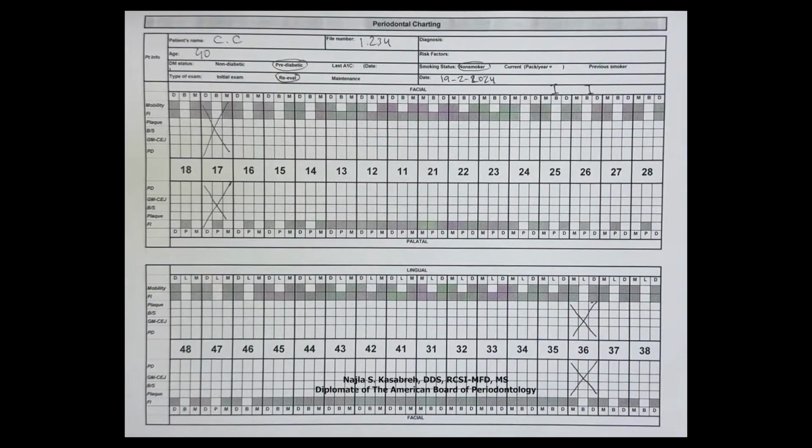On the left side, you can notice the parameters that you will be recording. You will record the pocket depth, the level of the gingival margin, presence of bleeding or suppuration, presence of plaque, furcation involvement, and mobility. Except for mobility, all other parameters will be filled out from the facial and palatal sides of maxillary teeth and from the facial and lingual sides of mandibular teeth.